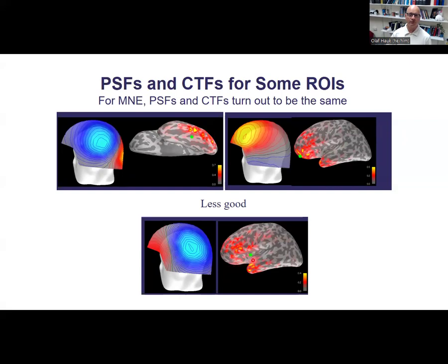And here, if we go deep into the Sylvian fissure, several centimeters under the surface, in this visualization on this scale here, you don't even see anything down there. So all of this activity spreads to the anterior temporal lobe and inferior frontal cortex, or the other way around in the crosstalk interpretation. If you wanted to extract the time course for this vertex here, you would actually get a lot of activity from the anterior temporal lobe and inferior frontal lobe. So this would completely overshadow the small signals that you may get from the depth of the Sylvian fissure. Could be the insula here, for example.